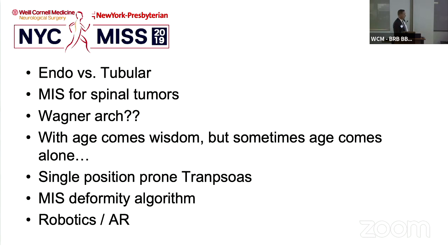Yeah, and I'll add to that. I think when you look at the literature, the penetration of computer navigation is only about 25 to 30%, depending on what data you look at. And a lot of the people that haven't switched over, notwithstanding cost and availability of advanced 3D image acquisition, it's because when they start the steep learning curve of computer navigation, if it makes an error, they don't trust it anymore and they stop using it, or they find it too cumbersome to constantly be shifting their attention to a remote screen away from the patient.